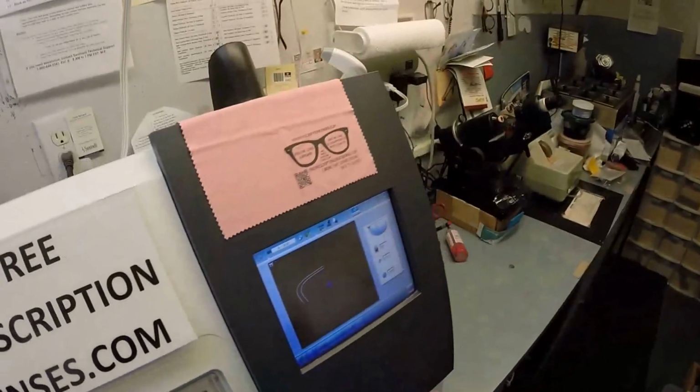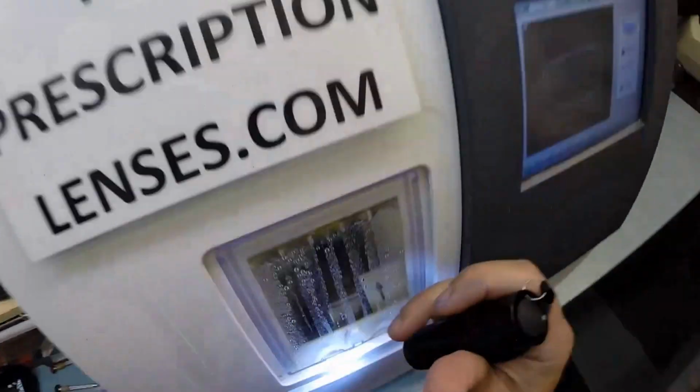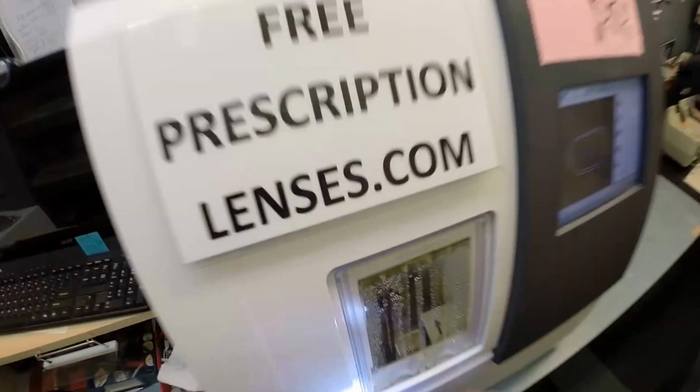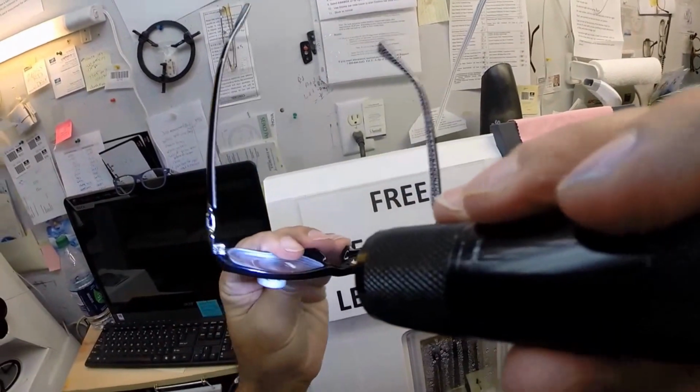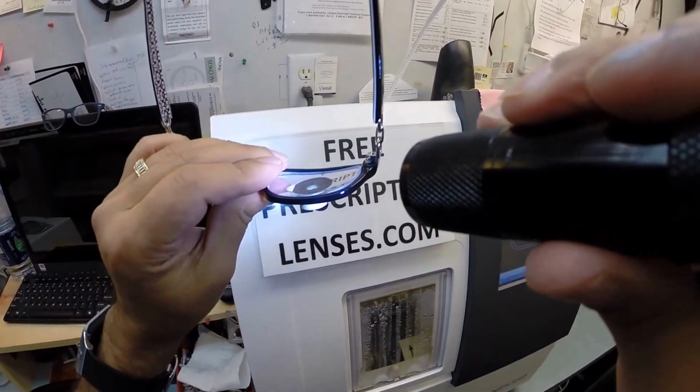Making sure it's large enough to fit into the frame. You can see as it's going around tracing that shape. And the old carpenter saying measure twice, cut once, measuring the thickness of the lens at every point to know where to place the bevel. So you have the least amount of edge thickness showing, and of course you have no edge thickness whatsoever in this frame.